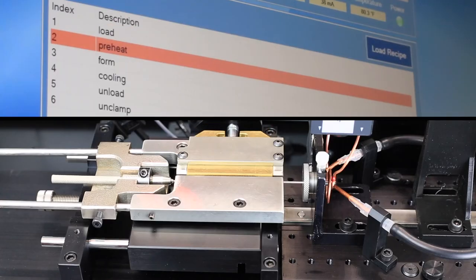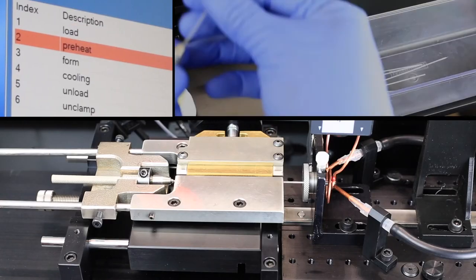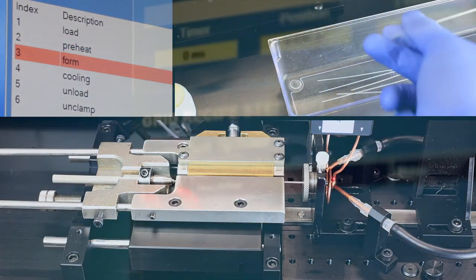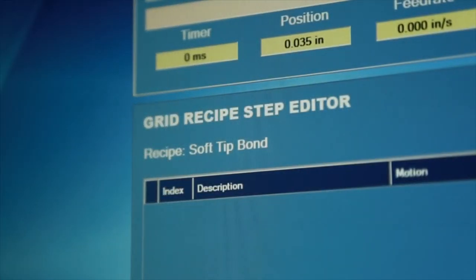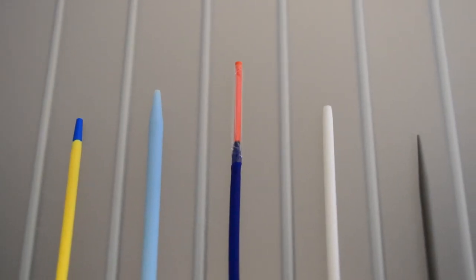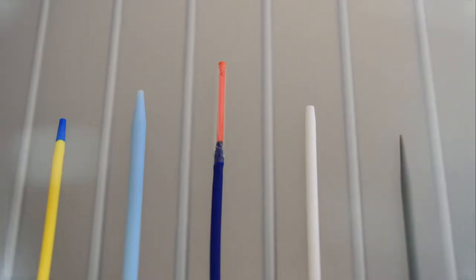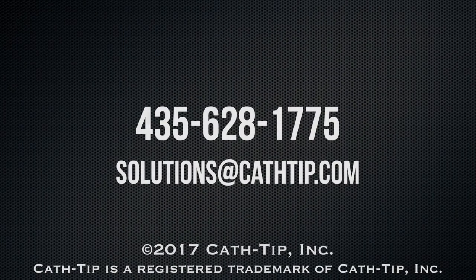The capability and simplicity of the grid style recipe editor allows you to create easy to validate recipes to get your product into production quickly.